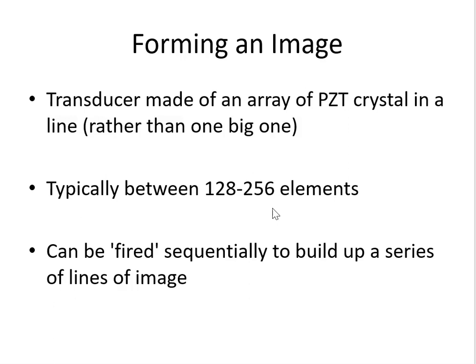So you're sending sound, waiting for it to come back, and then firing the crystals again, but doing this in very, very quick succession. And that allows you to build up lines of image based on these 256 different elements.